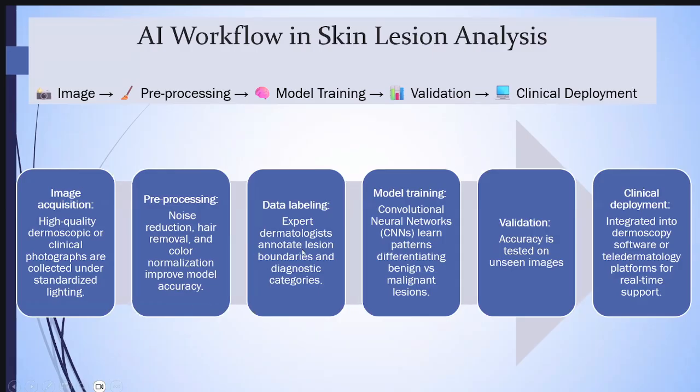And then expert dermatologists, here it is both the technical experts and the clinical experts, they have to sit together. They have to annotate lesion boundaries and diagnostic categories. This data labeling needs expertise from both ends.